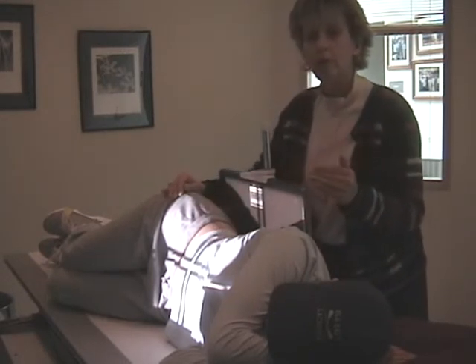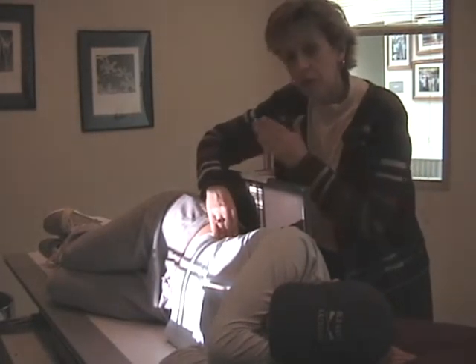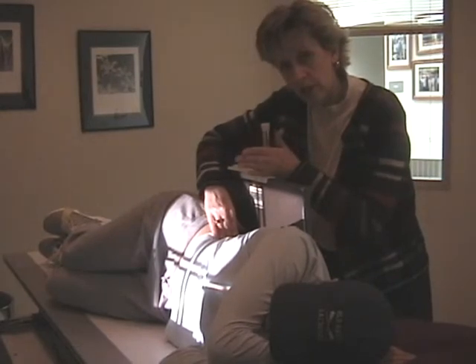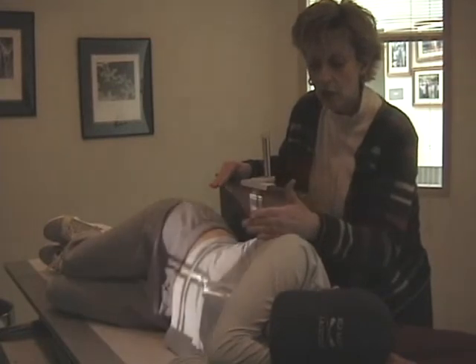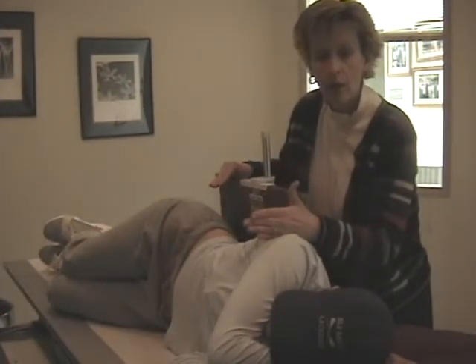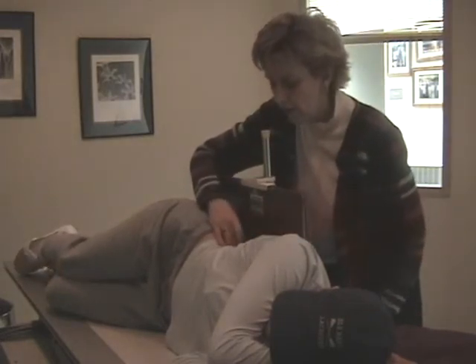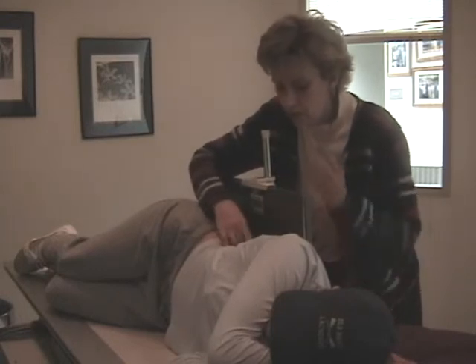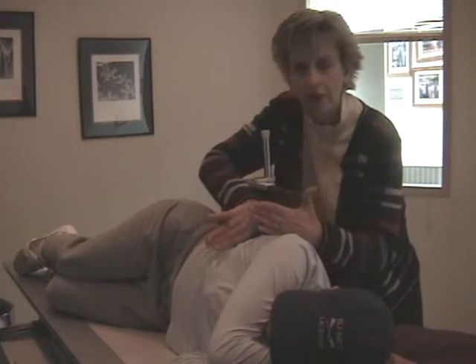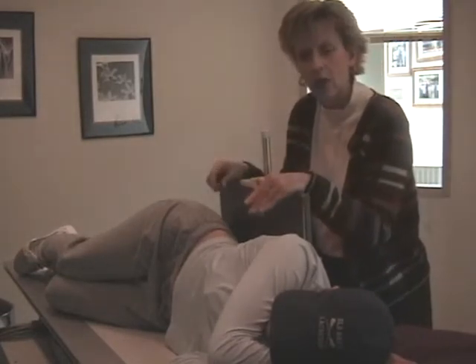Again, if we're after air fluid levels, we want the diaphragms on there. So I set the film up to have it level with the crest in the center first, but then I look at where my upper edge of the film is. It's close to the axilla, so I know I'm not going to clip diaphragm. You can also palpate a rib here, and this is probably her 11th rib coming down, so the 10th is here. You can see you have plenty of clearance above that 10th rib. So I'm not going to adjust the film higher because this patient does not dictate.